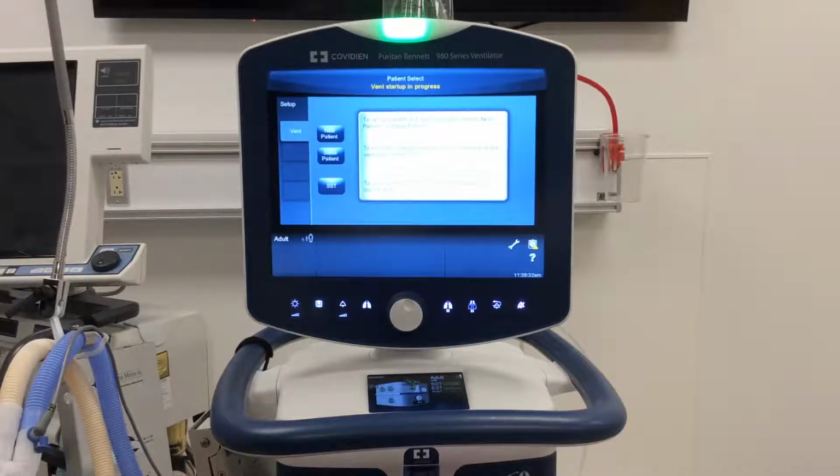So the thing to remember about ventilator settings is certain places you're going to have a physician that might tell you what's appropriate or what they would like to have the patient placed on after intubation. Now, even if you are at a facility where the physician is telling you to, it's essential that we can understand what is appropriate for that patient, okay? Likewise, you work in an emergency room or at other facilities where you have a little bit more freedom, this would be solely up to you, and you're coming up with settings, initiating them, and then bouncing them off the physician and letting them know what to sign the orders for.